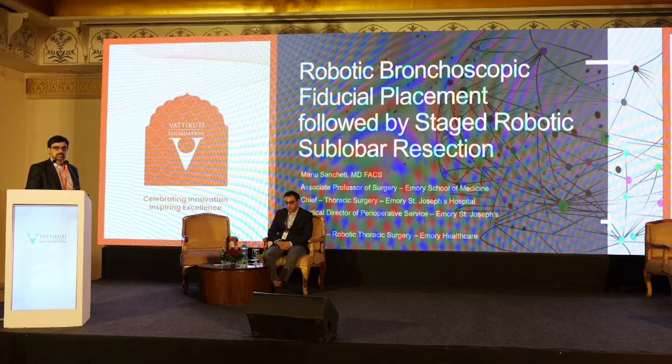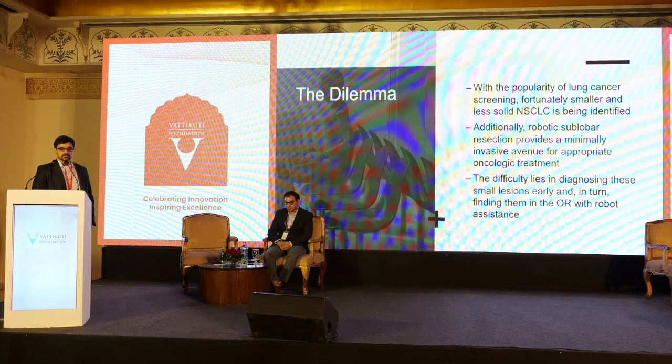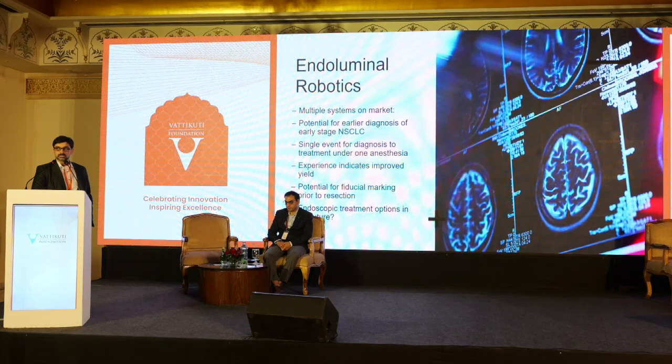So I have a couple of talks. This one is about robotic bronchoscopic fiducial placement for early stage lung cancer, followed by surgery. I'll go quickly through the first slides to get to the video. Lung cancer obviously has a wide incidence throughout the world, and fortunately, at least in the U.S., we're able to find cancers much smaller due to screening. So the difficulty is how do we diagnose these and how do we treat these without taking too much lung.